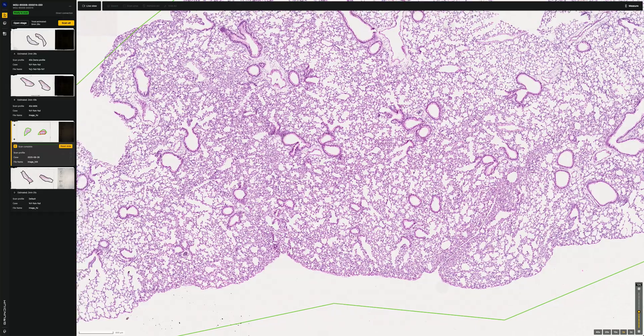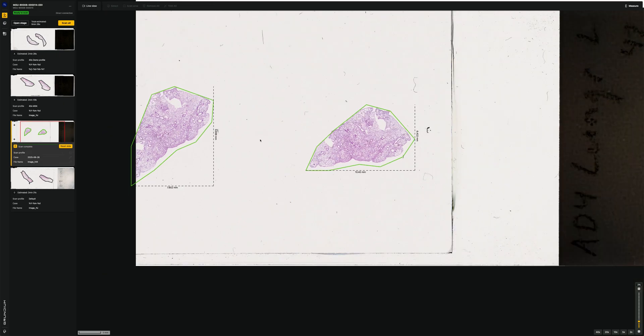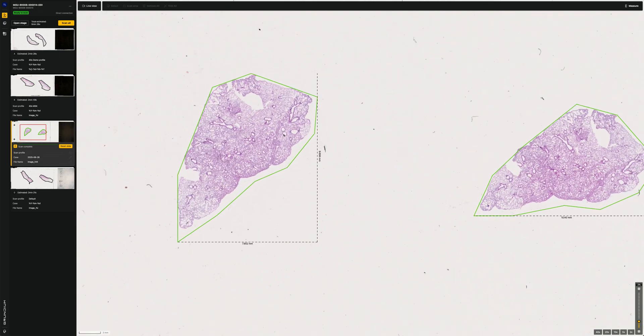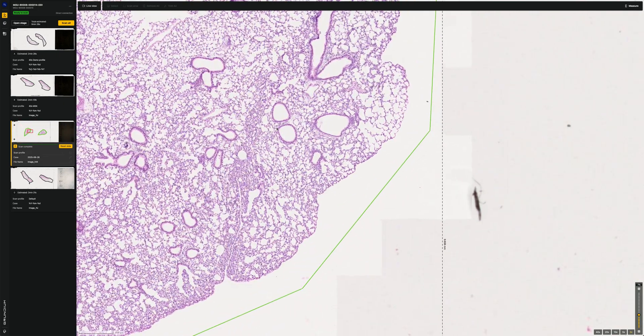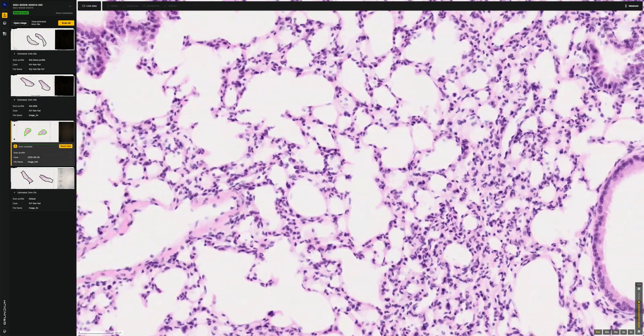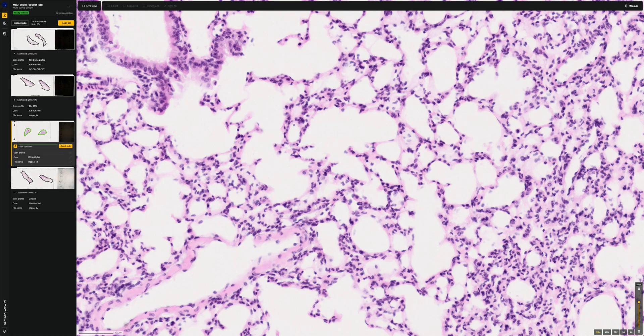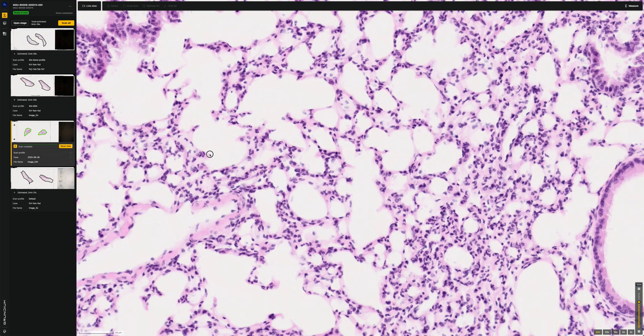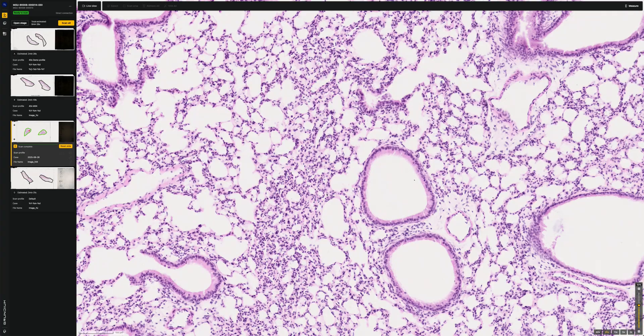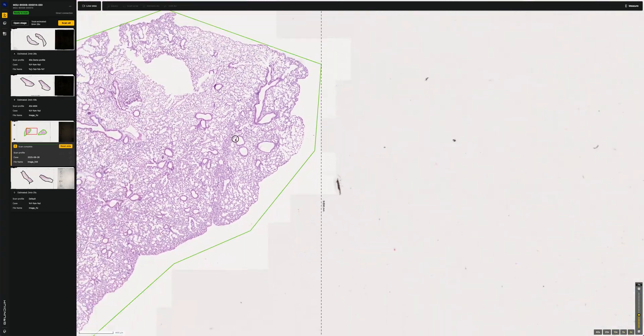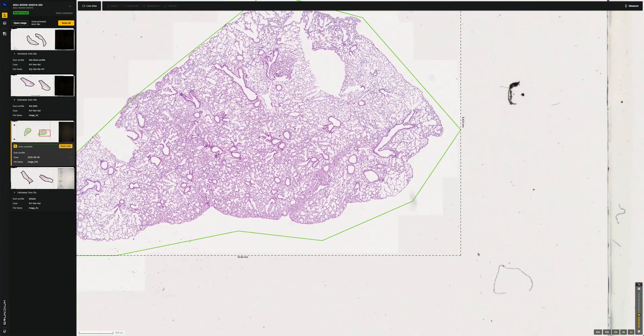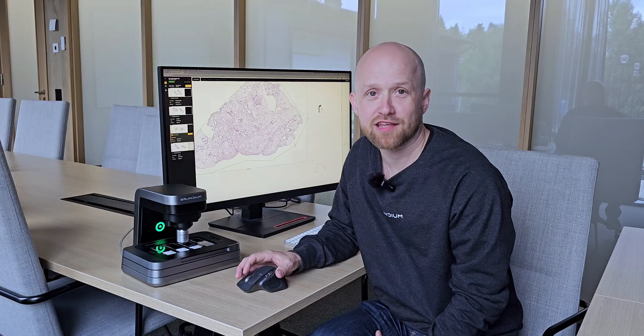And now that the whole slide is scanned, we can just move around in both of the scanned areas and zoom in using our mouse scroll wheel or the preset zoom settings or buttons in the bottom right corner. Just as easy and simple as it was with the previous systems.